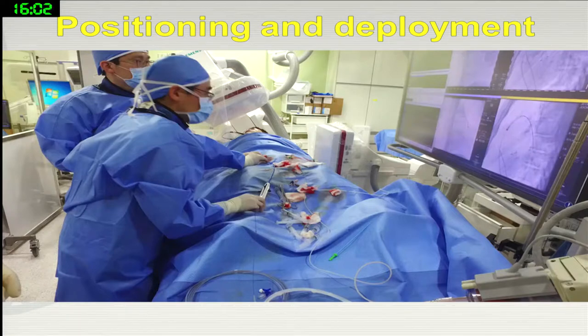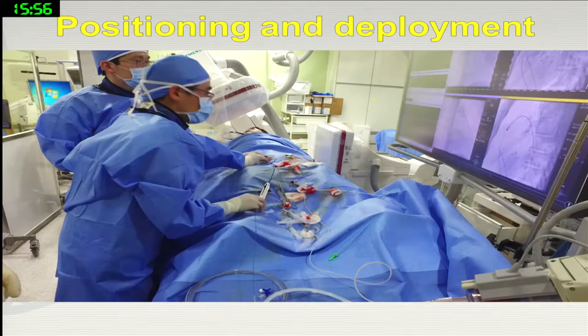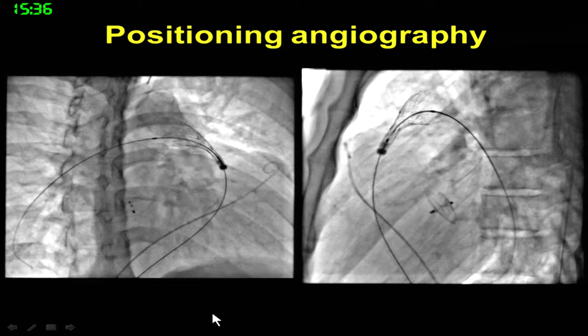Okay, then, about this valve: from the previous position, it can be completely retrieved and repositioned. Actually, from this position we can retrieve it, and this amount of half deployment also moves forward and backward well. From this partial deployment itself, we can move it. Okay, I see.